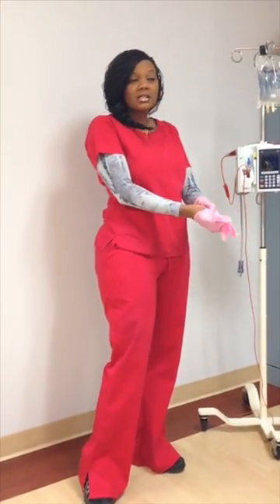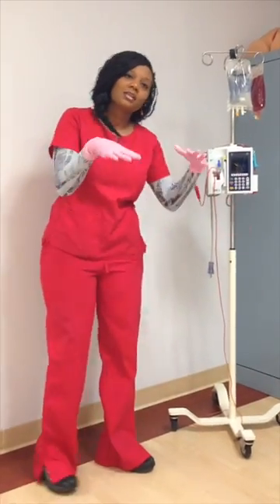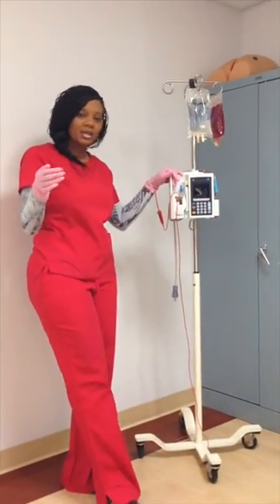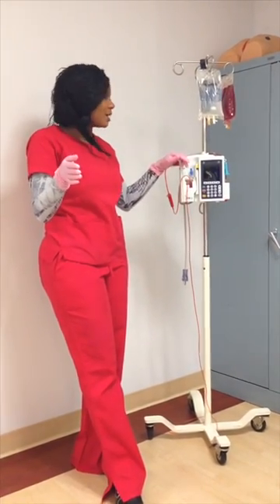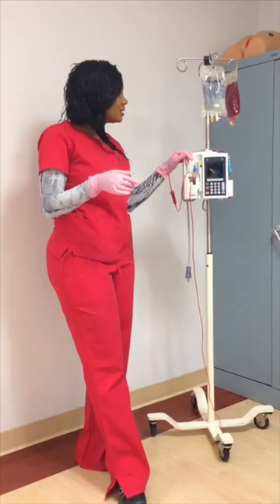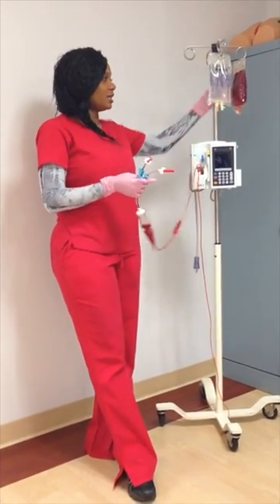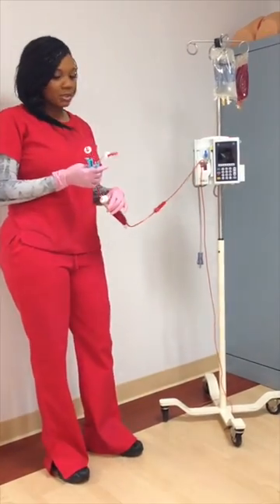After we've checked consent, and after you and the nurse have checked the blood to make sure everything lines up with the blood band, the blood unit, and the donor's compatibility with your patient's compatibility, we're going to go in. Things you may need: normal saline, your packed red blood cells, your IV machine, and of course blood tubing.